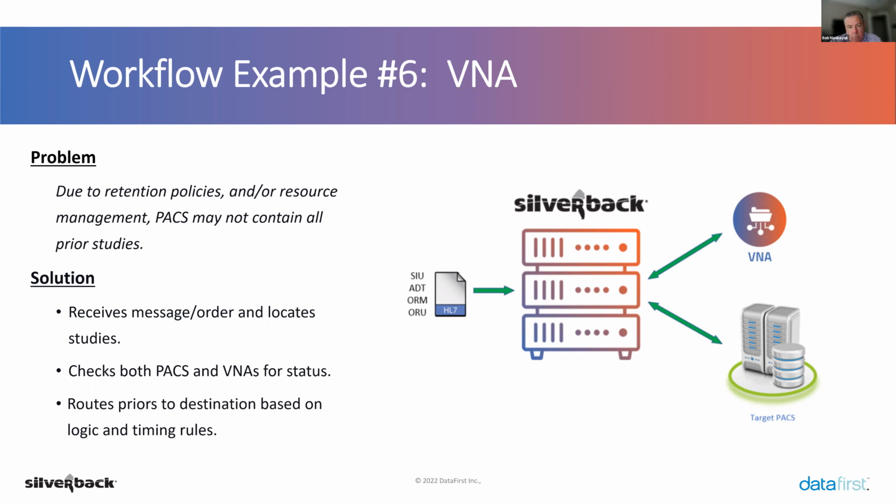That being said, we can deploy multiple instances of the application and have it reference a single database and assign the jobs that you need to those various VMs. So we kind of get there, but it's not truly modular. We can't just install part of it. But we do, by way of limiting functionality to those particular services in the way that we've segmented our product.